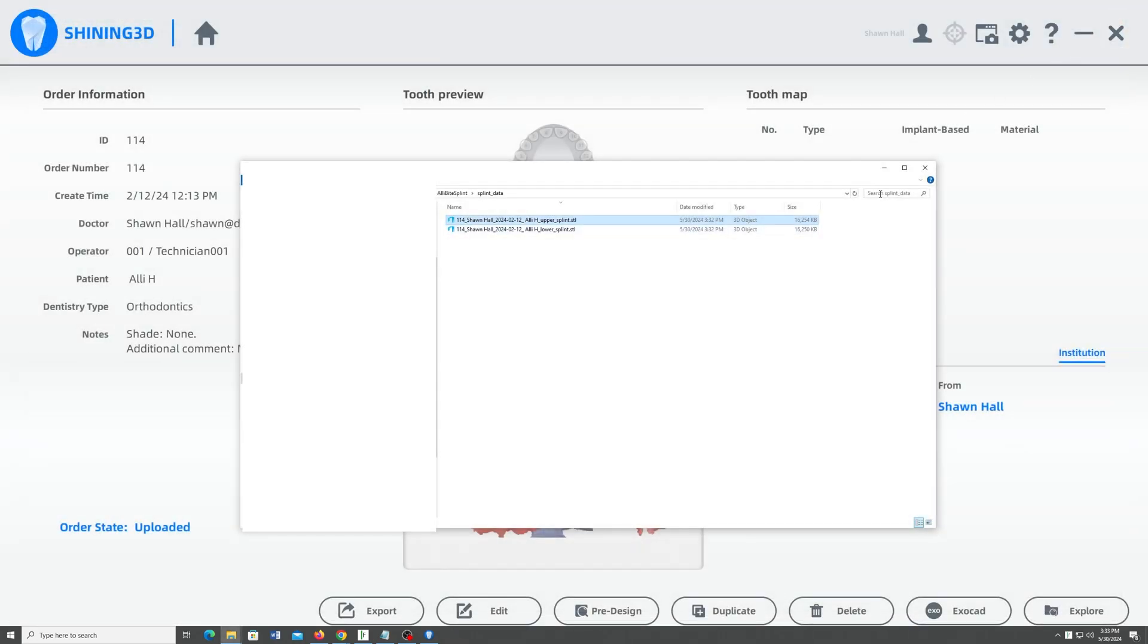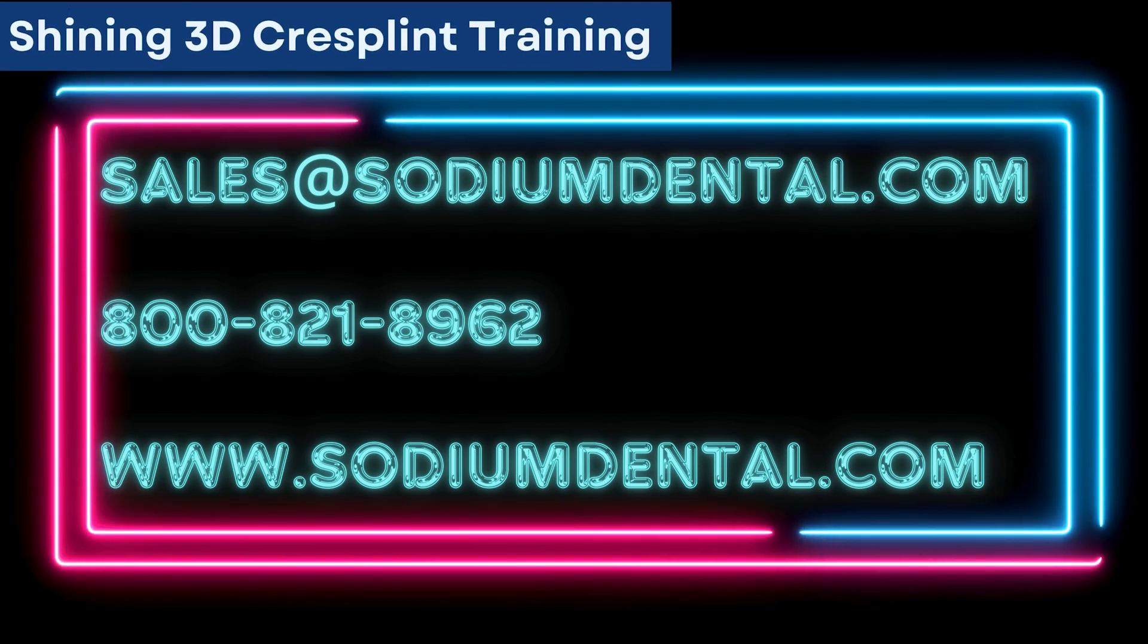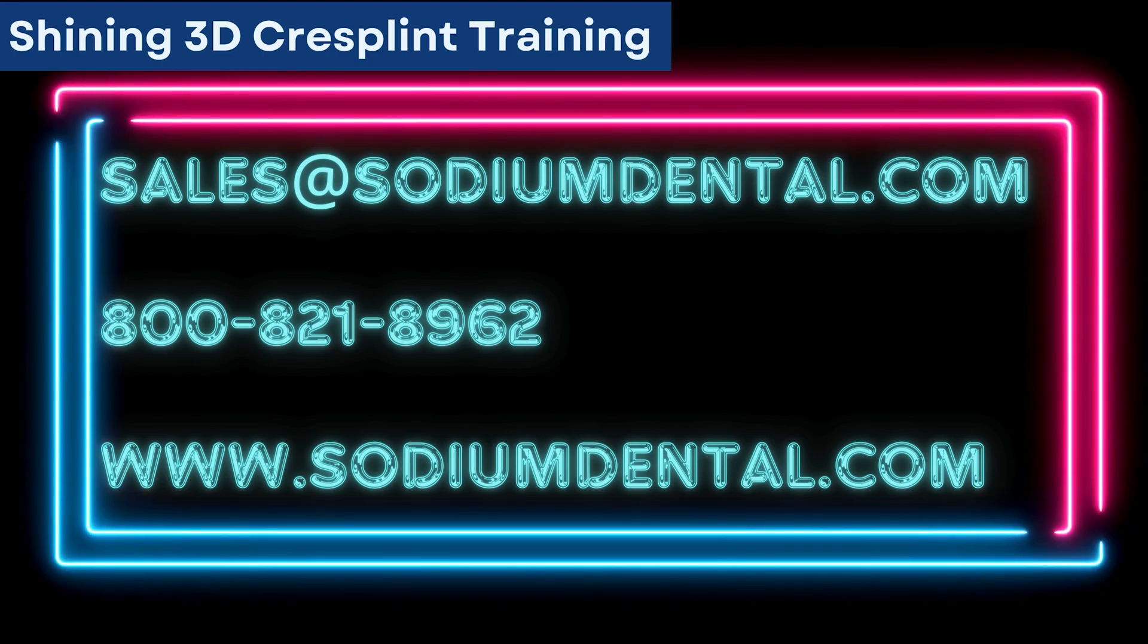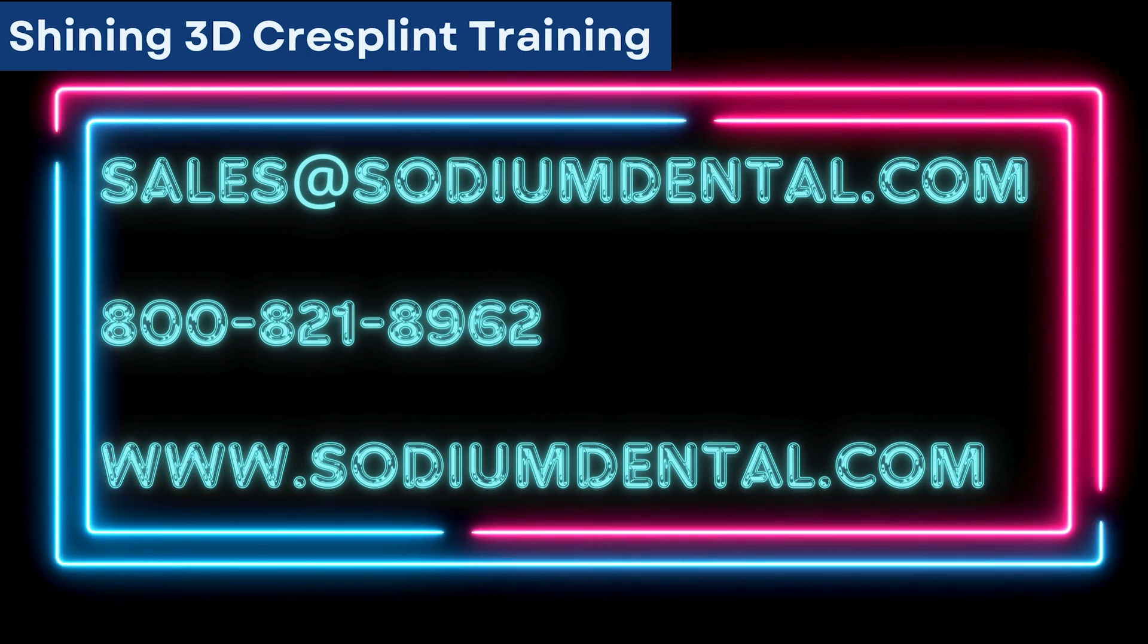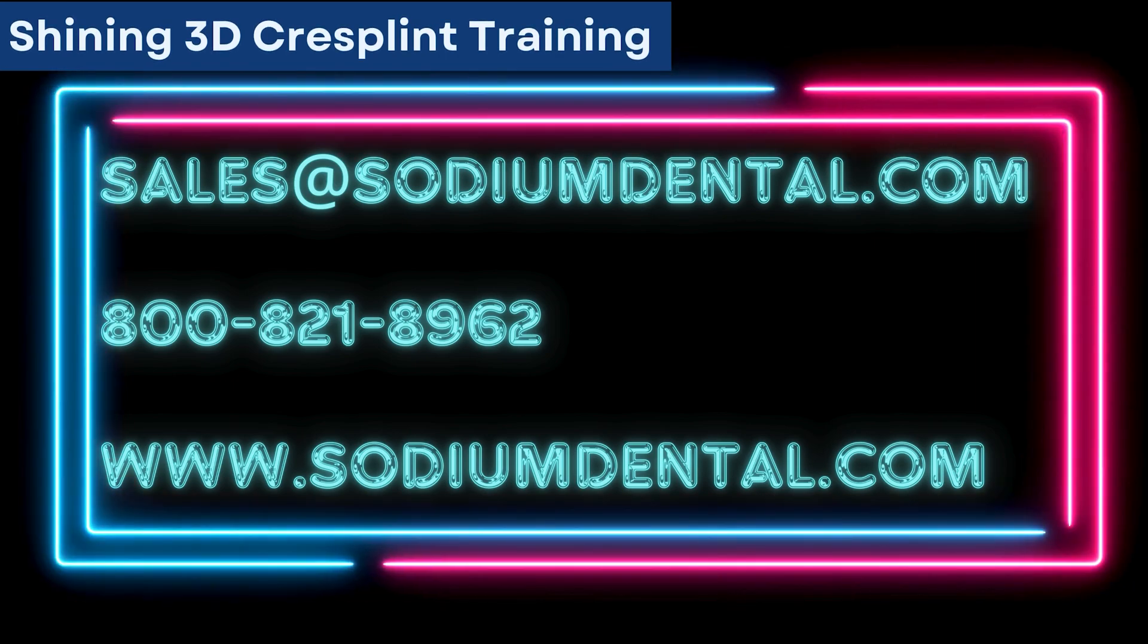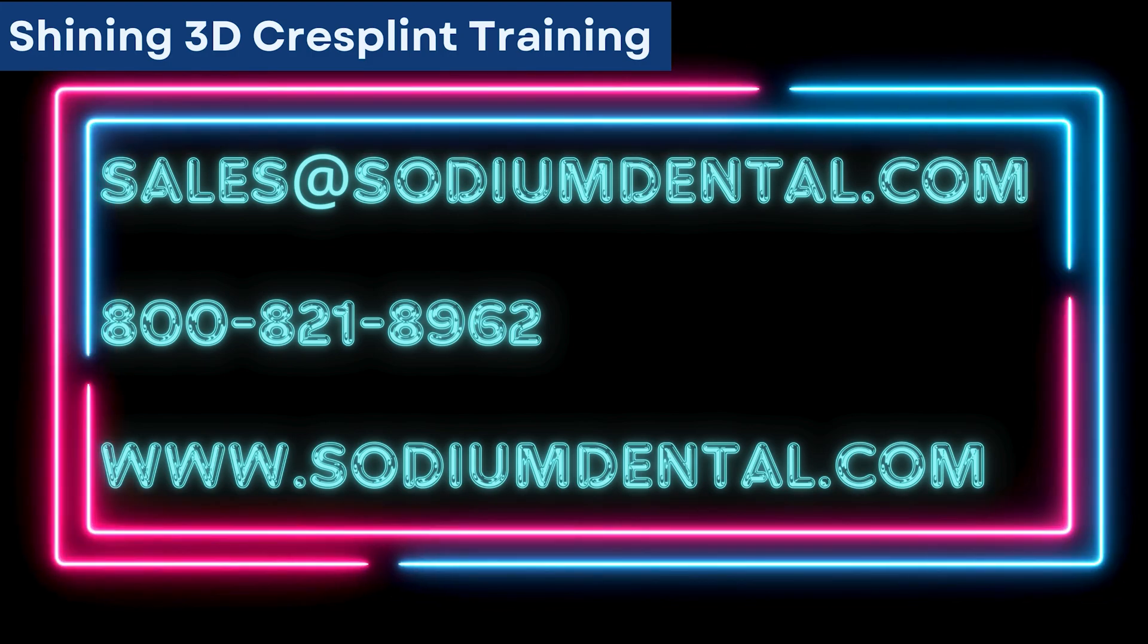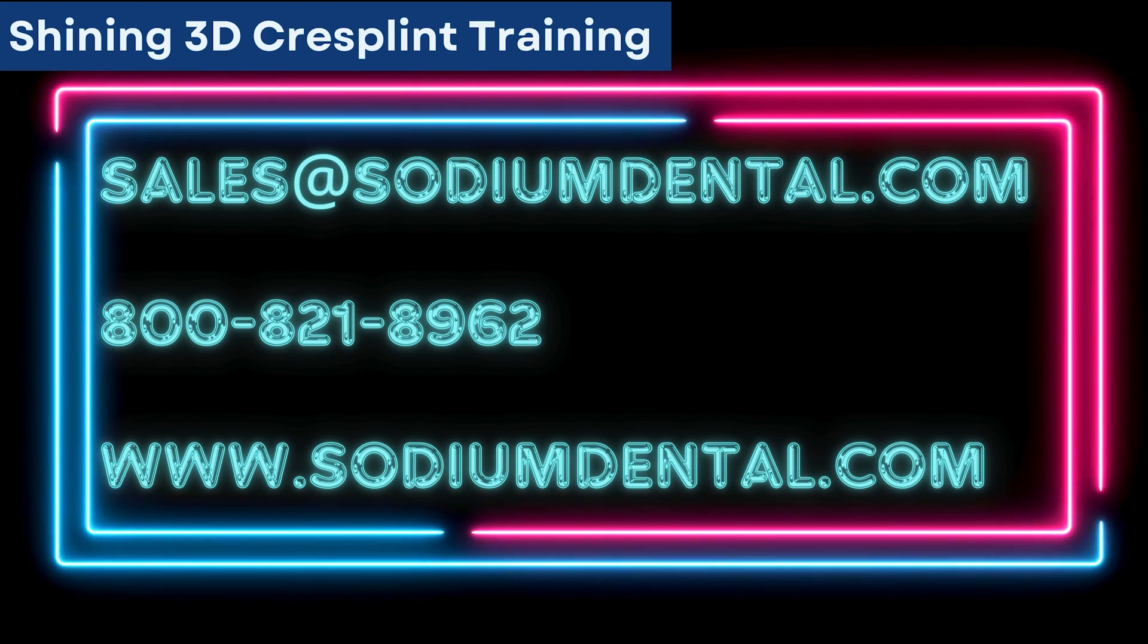So it's a super easy process. That's how to make a bite splint right out of the Aoral Scan3 software. Thank you for learning with me today. I am Sean Hall with Sodium Dental and this has been my video tutorial on how to use the new Shining 3D module, Cresplint, to design and print night guards right out of your free intraoral scan software that came with your Aoral Scan3 wired or wireless scanner. Always buy your Shining products from Sodium Dental because we will always be the best price and we are constantly expanding the video knowledge base we make available to our customers. With convenient trainings like these on all the new modules and other third-party design softwares that you may want to use to make your intraoral scanner more useful and productive in your practice.